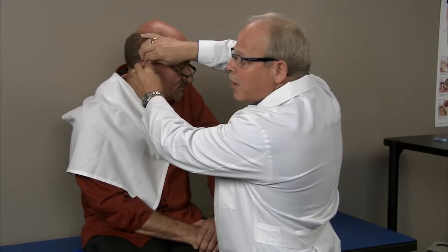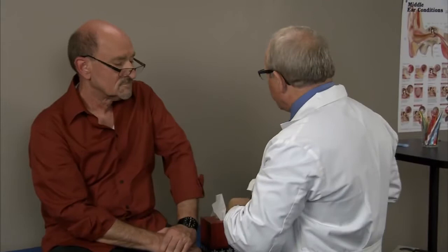After you finish your irrigation procedure, it's important to dry the patient's ear canal to prevent the formation of external otitis. I just use a piece of twisted Kleenex, place it at the entrance to the ear canal, and let it absorb any of the water that still may remain in the patient's ear canal. And then finally, once you're done with everything, make sure you discard the OtoClear tip. This is a single patient use device and should not be reused or recleaned.